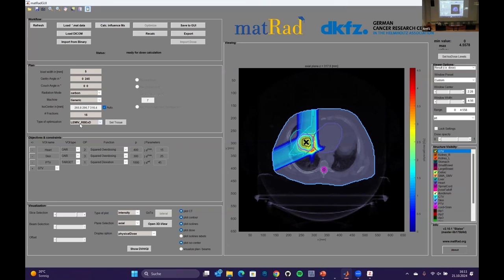So it basically tries to derive local dose distributions on the small scale and how they relate, or what they would be equivalent to, on a macroscopic scale, and then creates basically a model of the effectiveness.